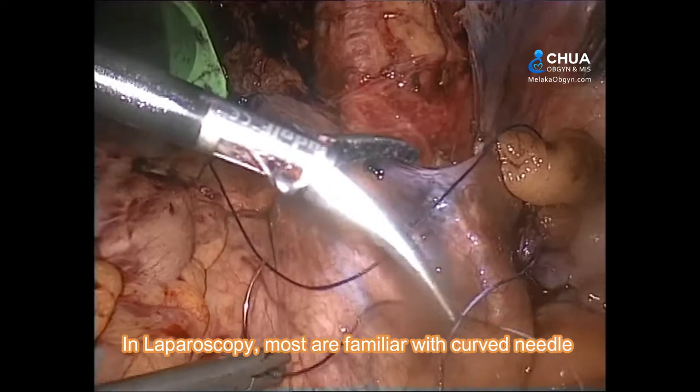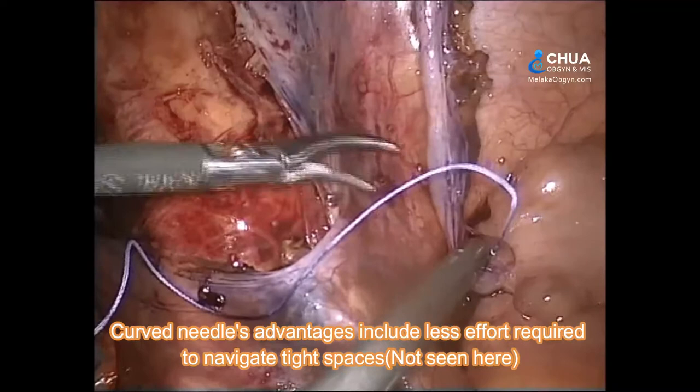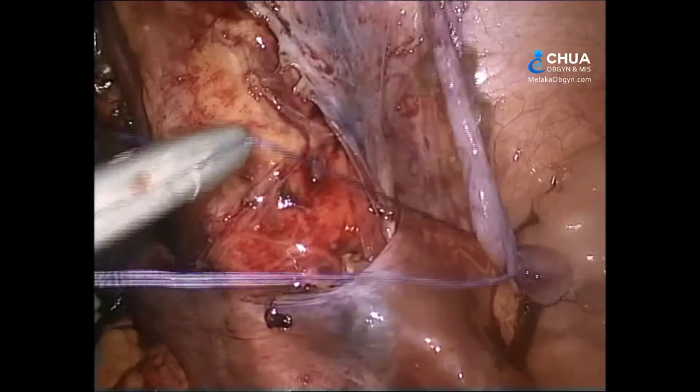This is a brief comparison between the curved and ski needle in minimally invasive surgery. In laparoscopy, most are familiar with the curved needle. Less effort is needed to navigate tight spaces with the curved needle.